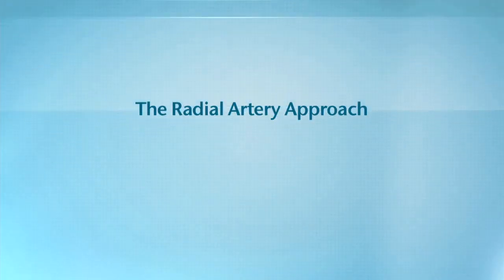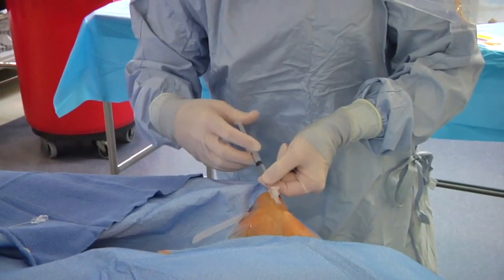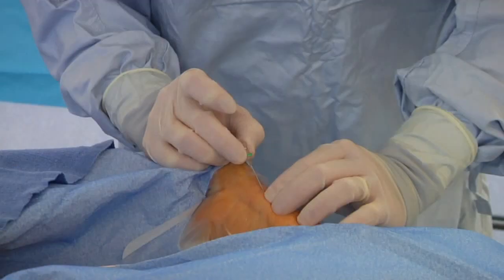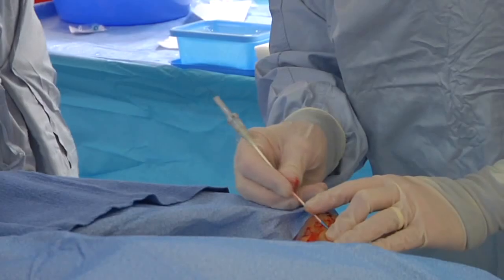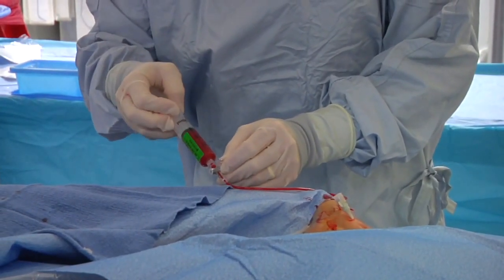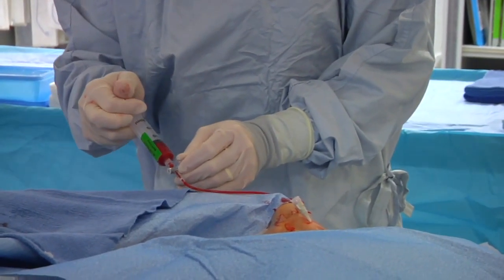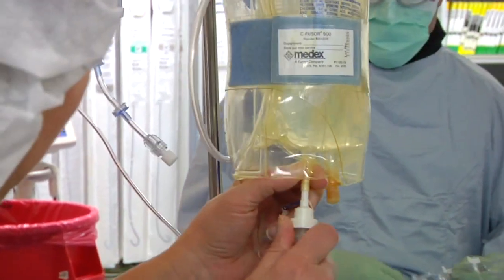Prior to the procedure, a nurse administers medication through a vein for sedation. The interventional cardiologist then delivers a local anesthetic to the wrist and inserts a tube or sheath into the radial artery. Medications are given through the sheath to relax the radial artery, which may cause a temporary burning sensation in the patient's upper extremity. A blood thinner, heparin, is also given to help prevent clots from forming.